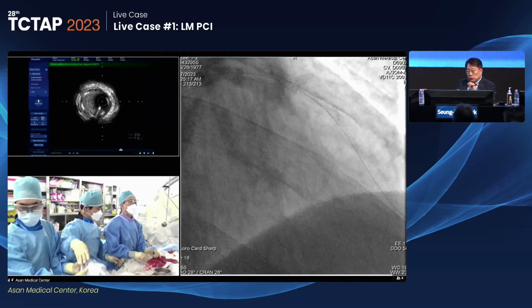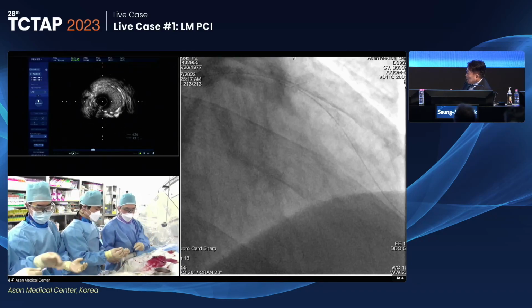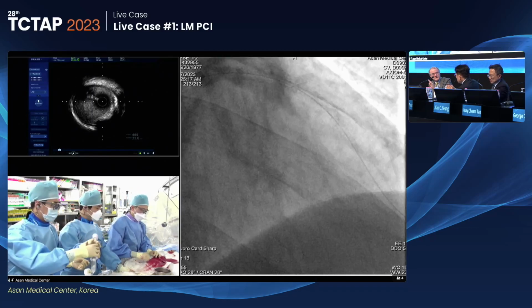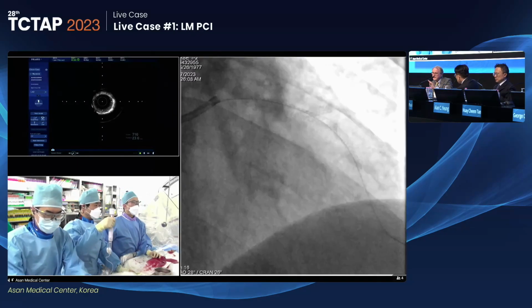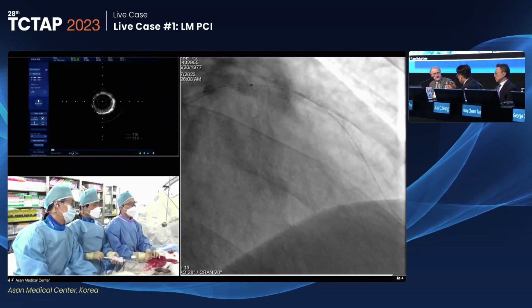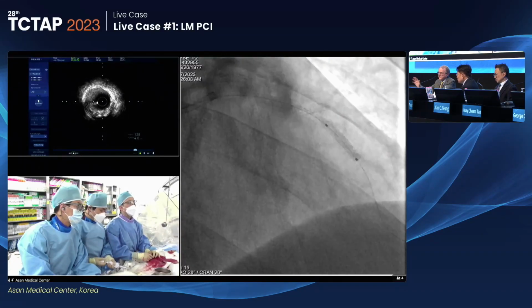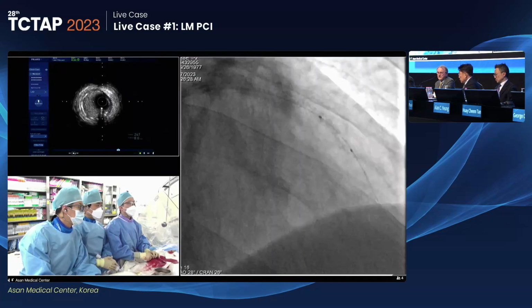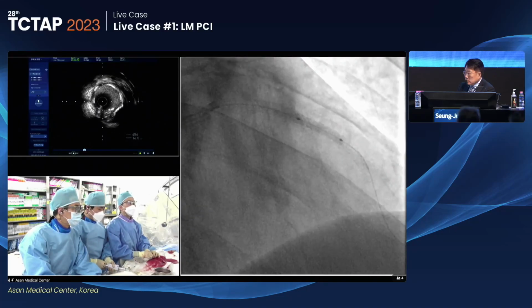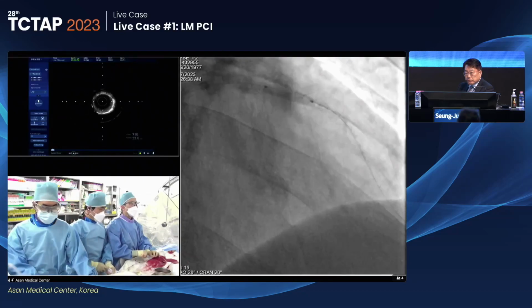3.0 NC, please. Antonio, so as you suggest, you want to do the kissing balloon inflation first, and then just the provisional stent? All right. And then DCB? Yes, do kissing balloon inflation and then make the decision. If the side branch is okay, I do kissing balloon with DCB. And the stent. It's the major branch, right? Sometimes even not to stent the major branch, but stent in the major branch is okay, and that makes the procedure a little bit more simple. So save the stent, right. But the decision comes after kissing balloon. 3.5, please. 24. Deflation.